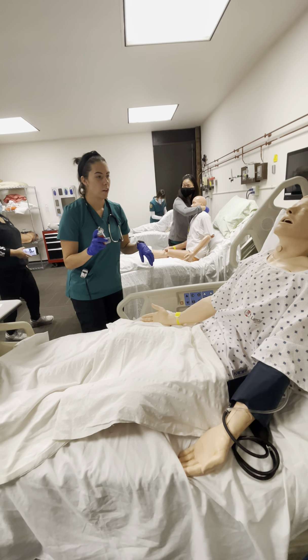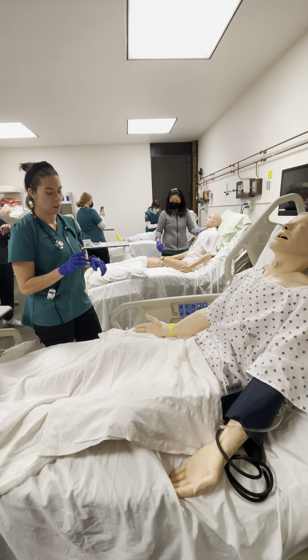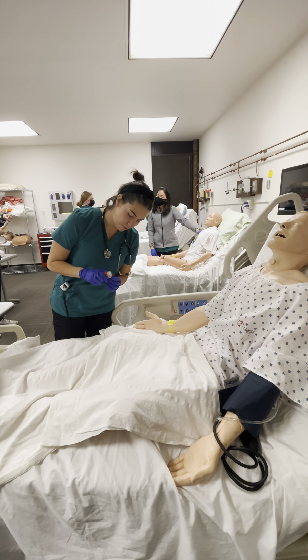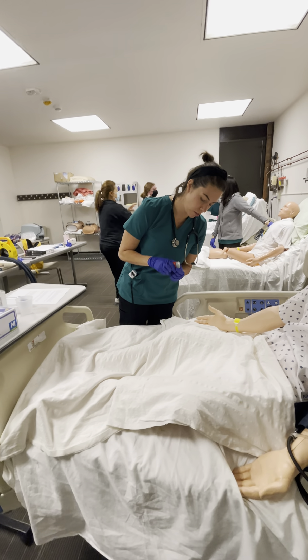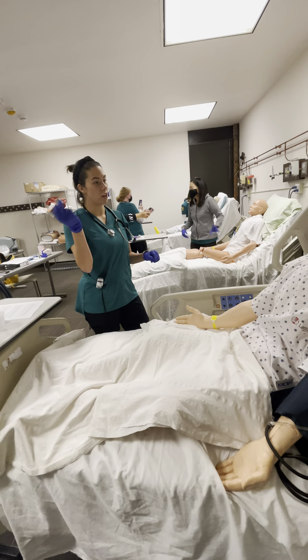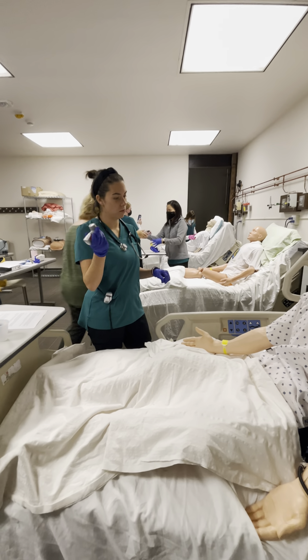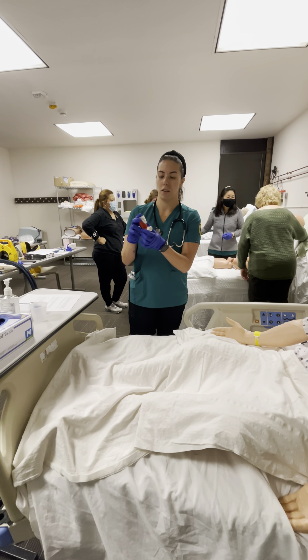Thank you. All right, I'm going to show you how to use this — it's an inhaler. Have you ever used one before? Perfect. So on the top of the canister, you're going to see how many doses you have left. We're going to go ahead and shake the canister really well.